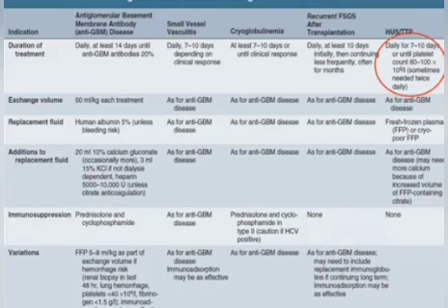Sorry, if you reach a platelet count of 70 to 80 to 100,000, then you may space the sessions, make it every other day or so. But in the beginning, with a very low platelet count, you should perform it daily and sometimes twice a day.